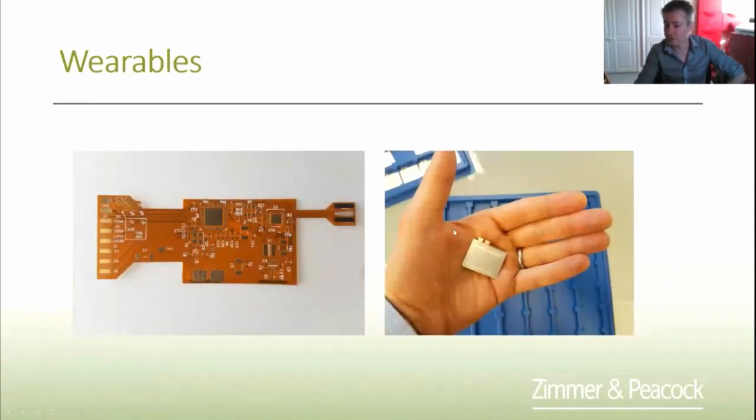What's very big at the moment in biosensing is actually wearables. Everyone wants to do continuous glucose monitoring in diabetics, CGM, that's very big at the moment. Lactate monitoring in athletes, people are very interested in that at the moment. Hydration monitoring. And the nice thing about electrochemistry is you can have your sensor and electronics all in a very small package. And this little silver square here is actually the battery. So thin batteries married with electronics and integrated biosensors gives you a very nice wearable type platform.